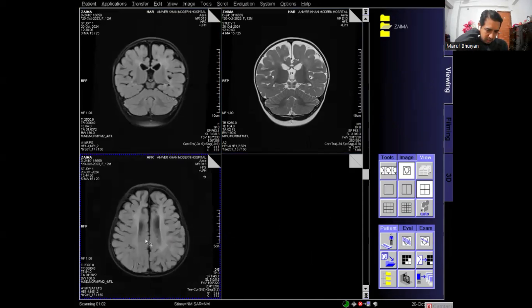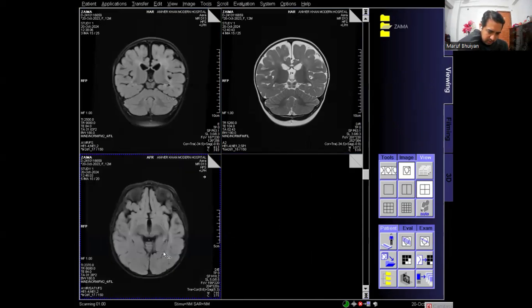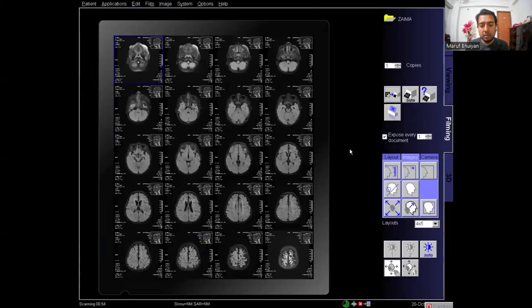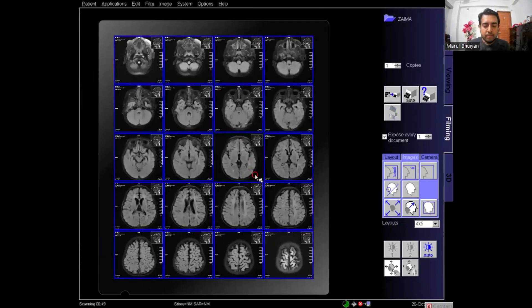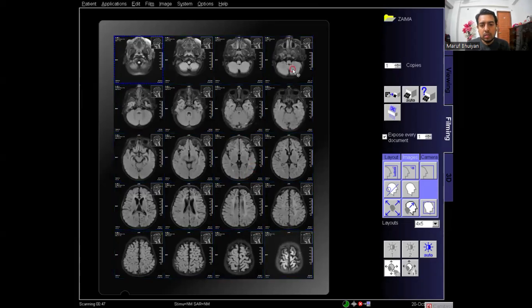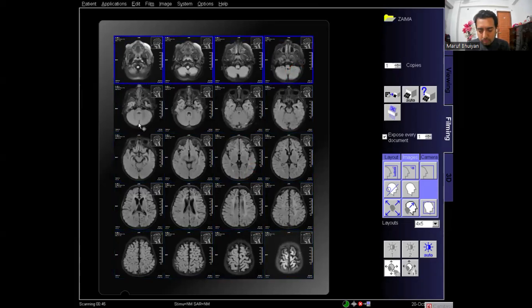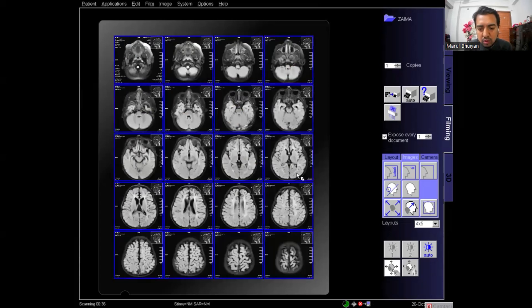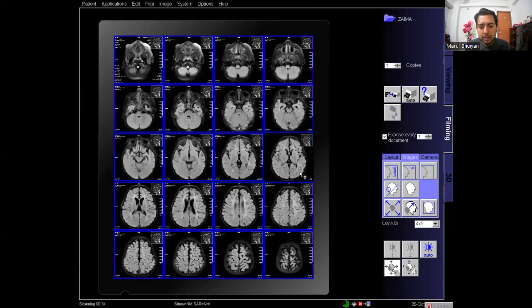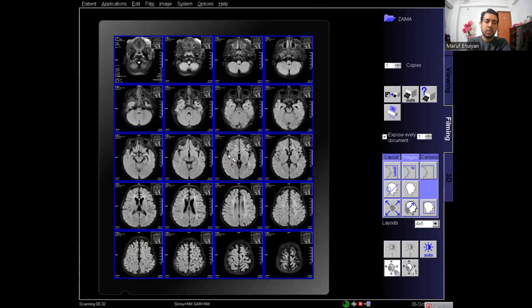This is the dark fluid axial series. I select the series and send it to filming, then go to the filming screen. I zoom pan the images so they fit in the segments, and also set the window level — the brightness and contrast of the image.